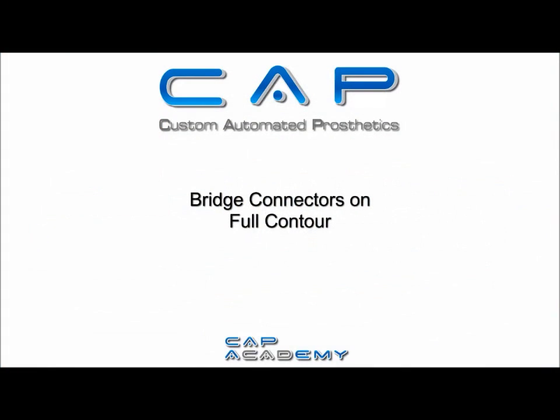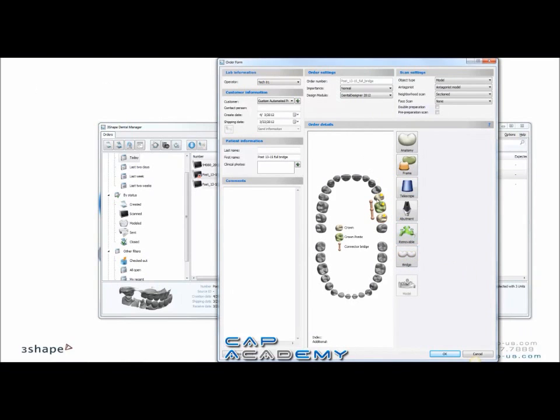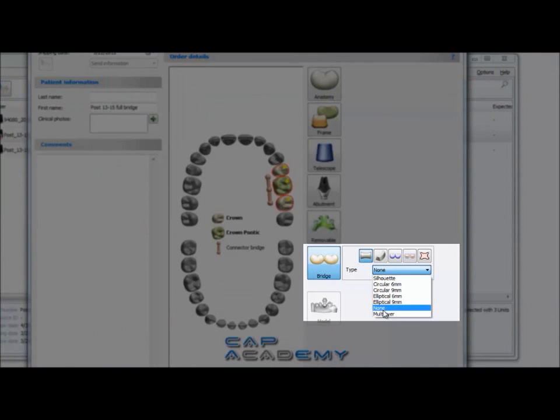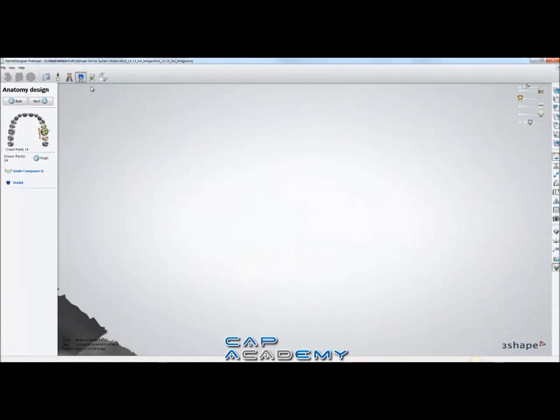At first, I want to show you bridge connectors on full contour. This is a much better way to do full contour bridges, much more superior than using Silhouette or any other bridge connector. So here we just have a three unit bridge, and it's a full contour zirconia. If you select all three, you'll see under bridge, the type should come in default as none. If it is Silhouette, you can drag it down to none, and you can actually change this within the case if you have it set correctly, and I'll show you that really quick.